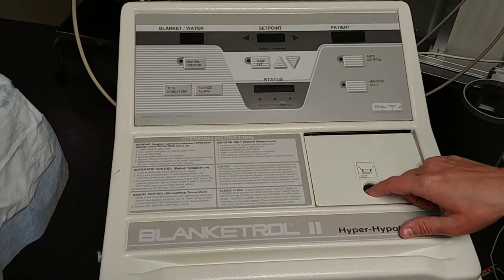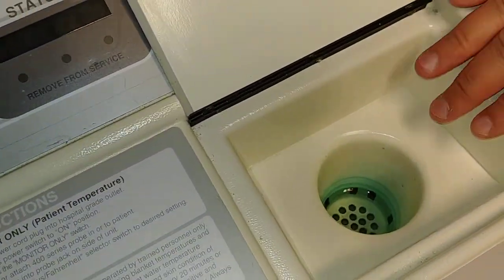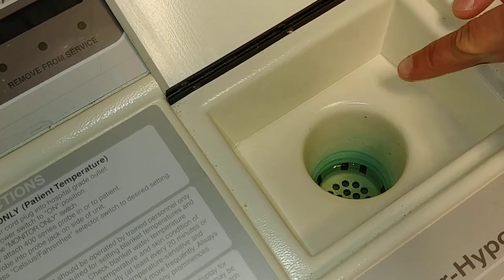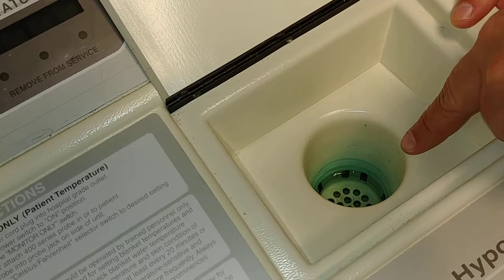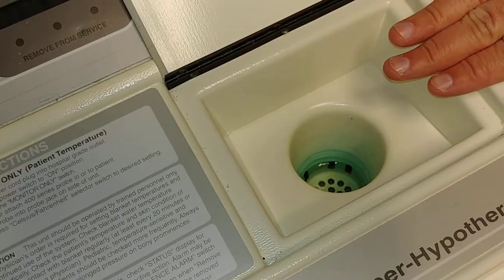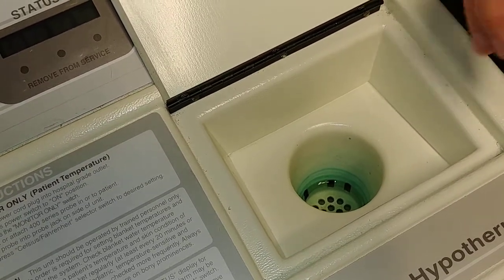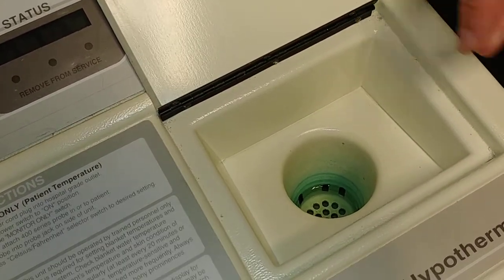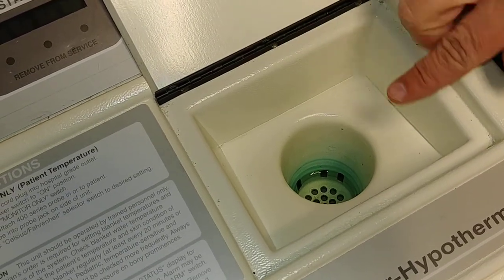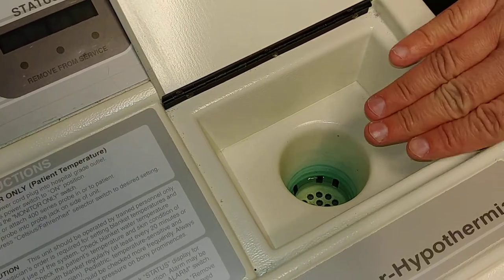Once all of that is complete, check the water level of the cooling blanket machine. You want to make sure that the water is visible and covering all of the little holes. If the water level is not visible, obtain sterile water from one of the PICUs, and add some sterile water, making sure not to overfill — just enough to cover the holes.